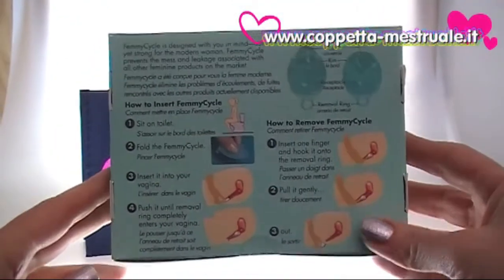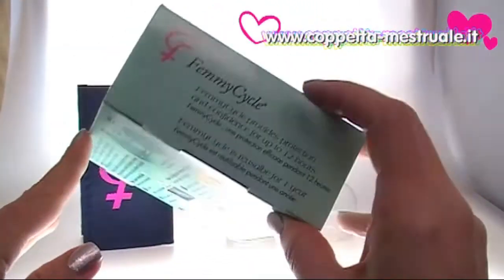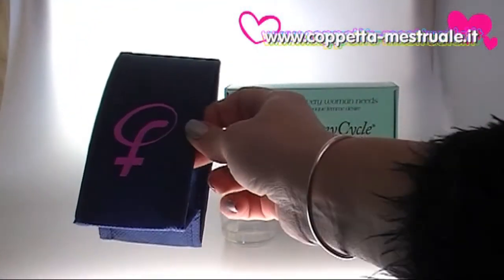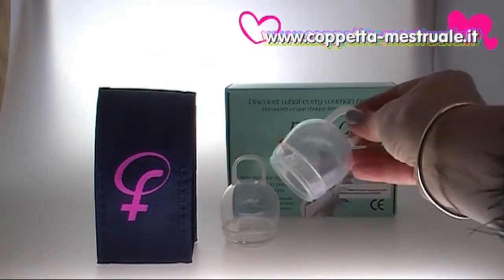You can see instructions in English on the outside of the box, but you'll find instructions in your own language on the inside. The box also contains a carrying bag with the Femicycle logo on it and two Femicycle menstrual cups.